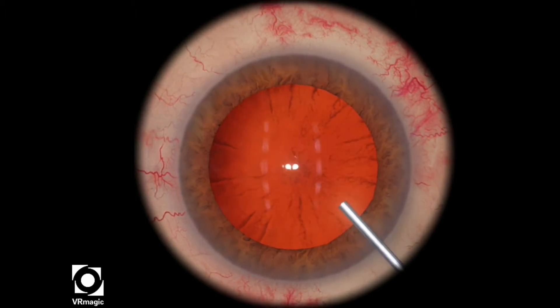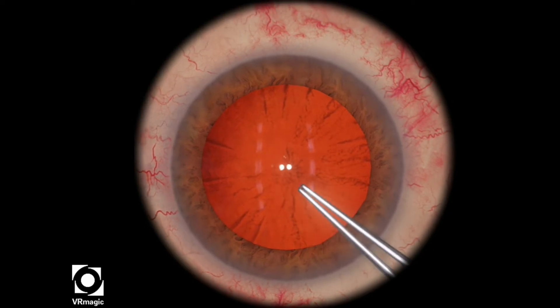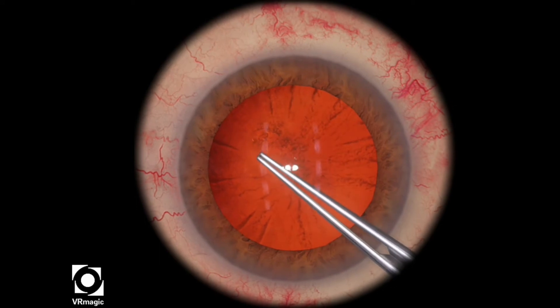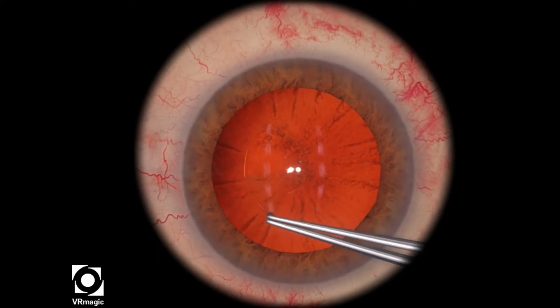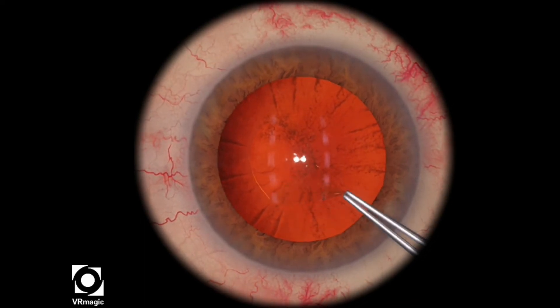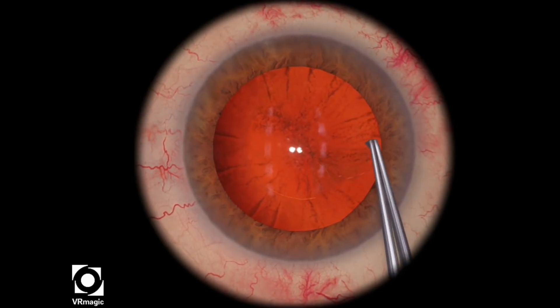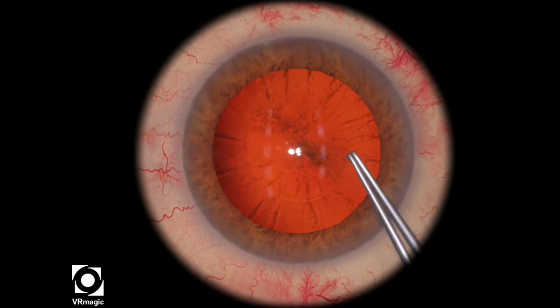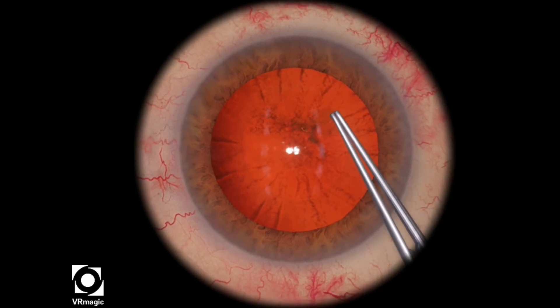So here you just want to start off with putting a bit of viscoelastic, and remember that the zonules are quite loose in this particular lens. You just really start off in the regular fashion — I create my flap and then I rotate it, trying to keep in mind you're attempting to create the perfect circle around the pivot point, which is your Purkinje images on the microscope — those two little dots there.